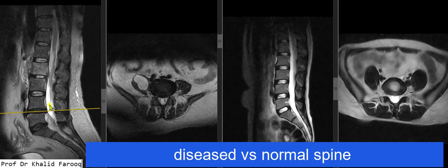...we can see there is reduction in the hydration pattern of the lower two lumbar discs, suggesting disc desiccation or degenerative changes in these discs. There is no soft compressive disc disease, as all the discs are within their normal position.